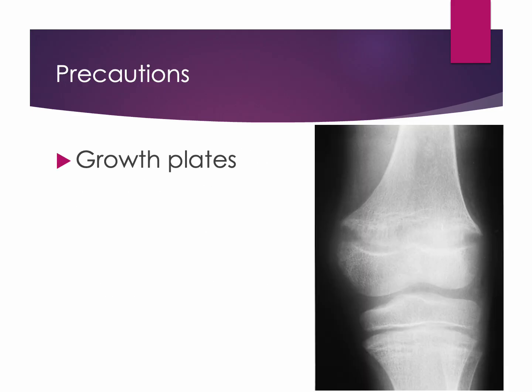Thermal ultrasound is generally avoided directly over active growth plates, also known as epiphyseal plates, in children and adolescents. Growth plates are regions of developing cartilage located near the ends of long bones where bone growth occurs during skeletal maturation. Because cartilage absorbs ultrasound energy differently than mature bone and soft tissue, there is concern that excessive heating could potentially disrupt normal growth plate physiology.